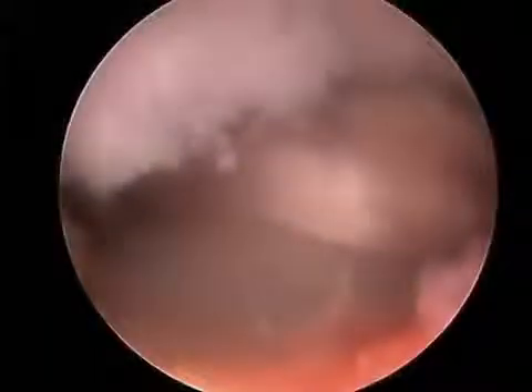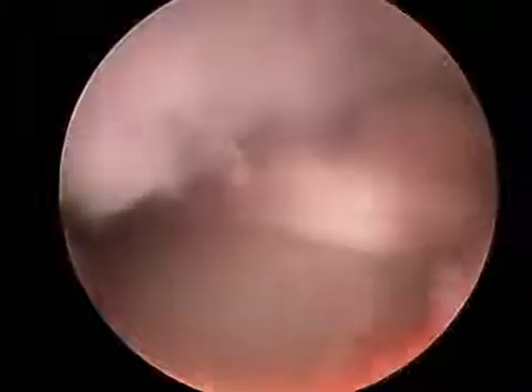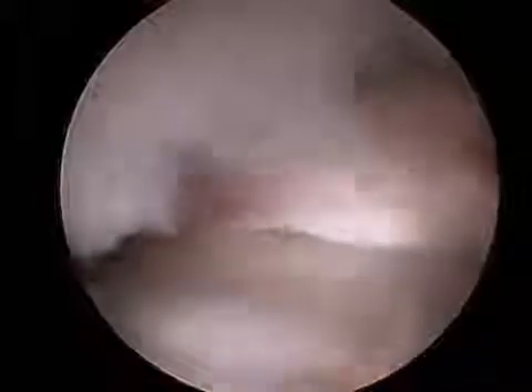A burr will be introduced into the hip in order to remove the bump and recontour the femoral head and neck junction to remove the cam impingement. The burr is used to sculpt the femoral head and neck junction where the cam lesion was causing impingement on the labrum, thus causing the patient's labral tear.